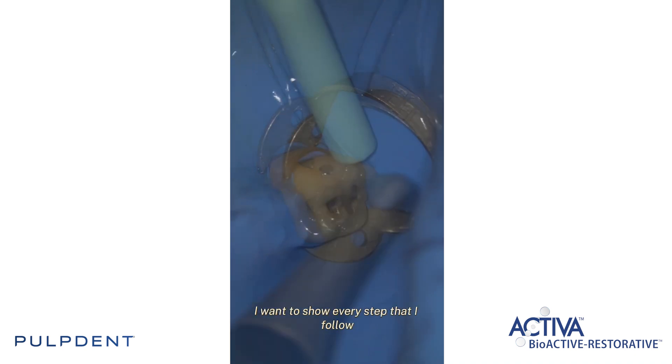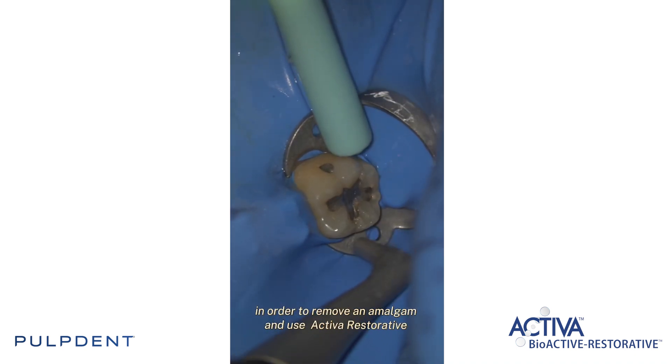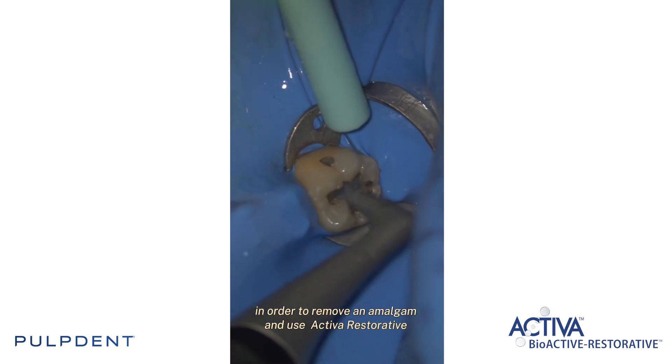In this short video I want to show every step that I follow in order to remove an amalgam and use Activa Restartin.